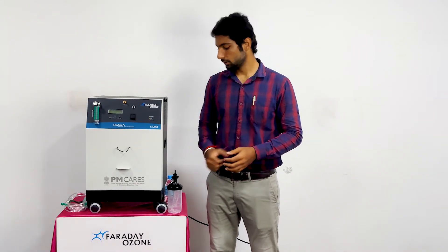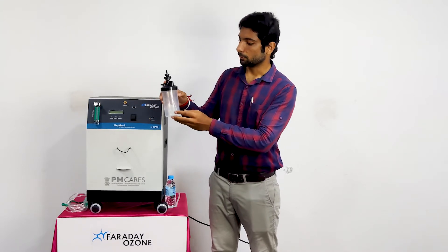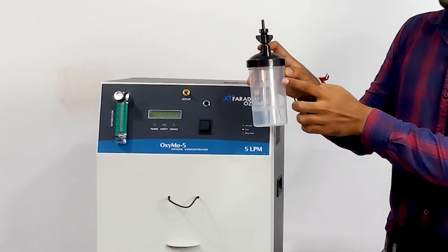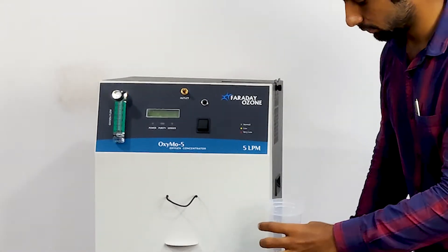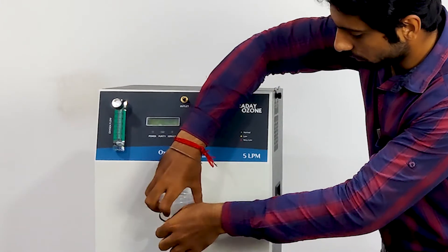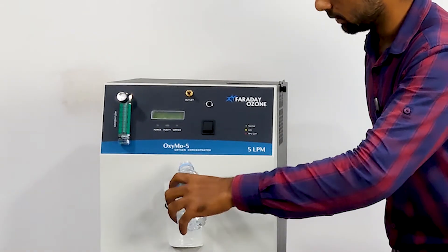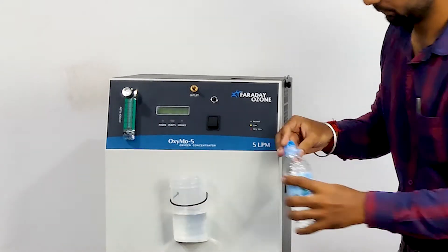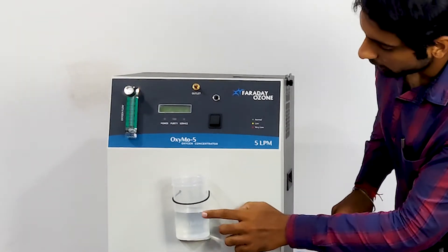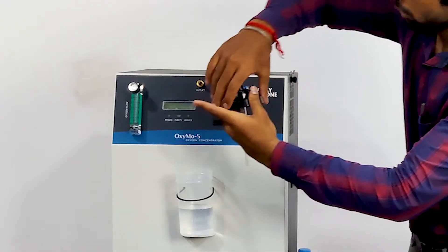Let us see the operation of this Oxygen Concentrator. First, take the Humidifier Bottle and fill it with distilled water or any pure water. The water level should be above the minimum and below the maximum. I am taking a bottle of water and filling it below the maximum.